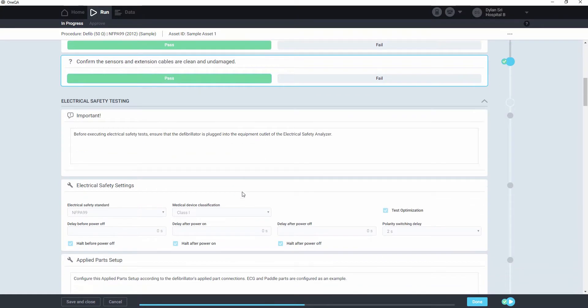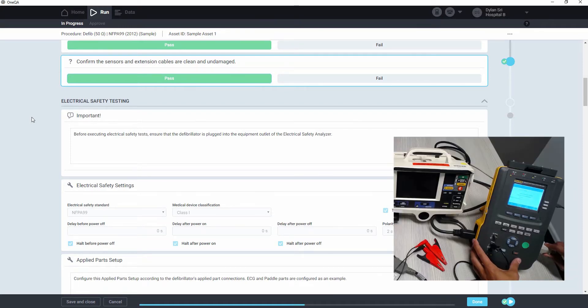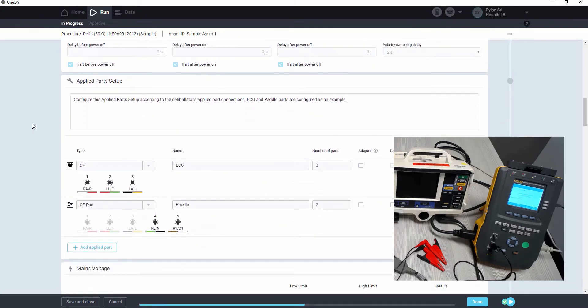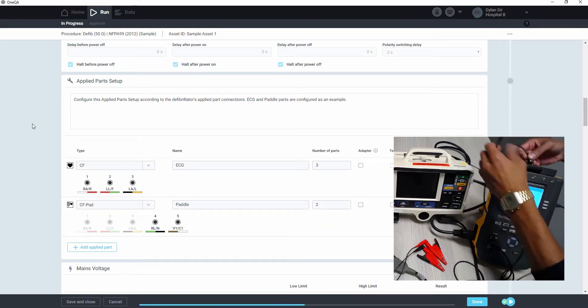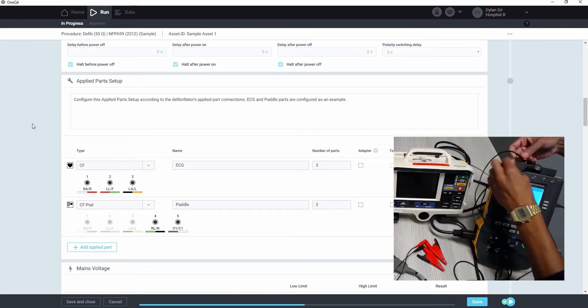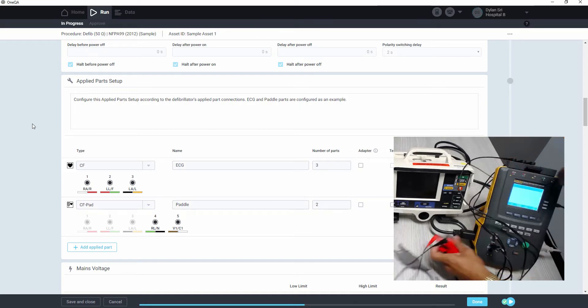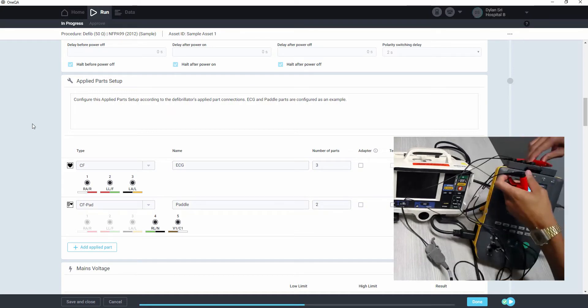Once we get to electrical safety testing, we want to make sure that our defib is plugged into the equipment outlet on the ESA, and that the applied parts are connected, as described in the applied parts setup component. These are our paddle leads.